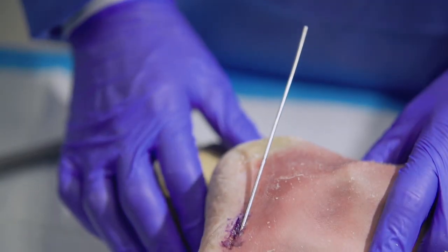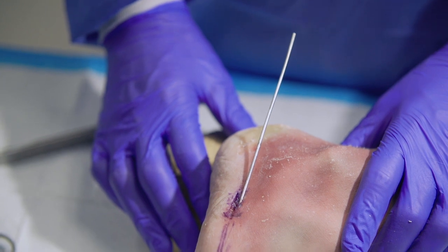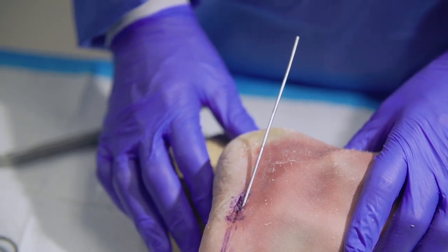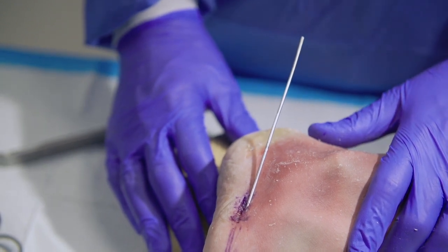Utilizing the targeting guide, we've determined that we will be using a 5 millimeter by 60 millimeter solid screw, but we'll utilize cannulated technique. The Asinus system has both cannulated and solid screw options available.